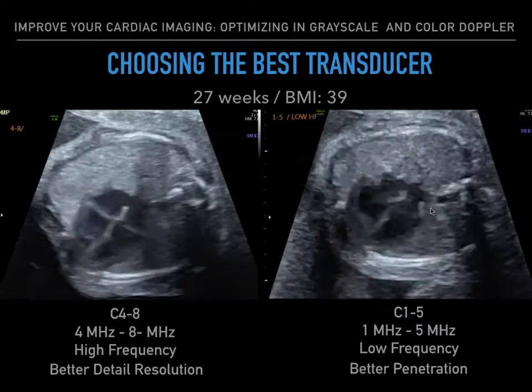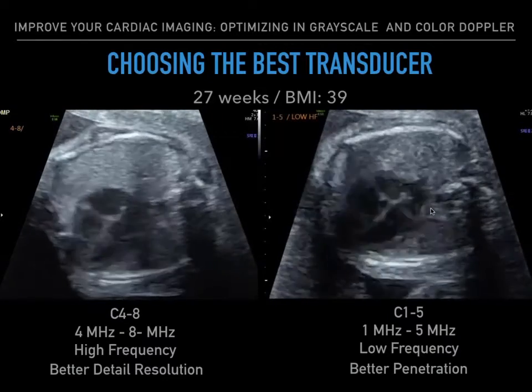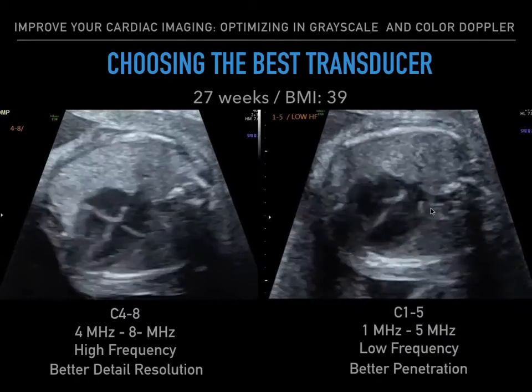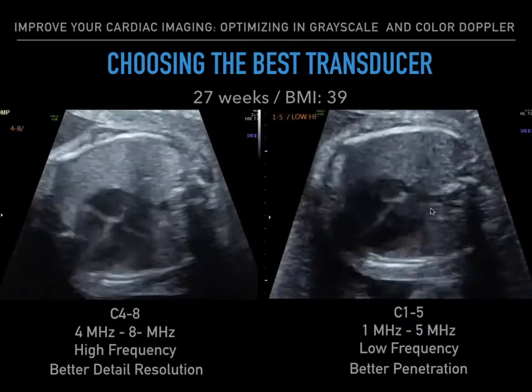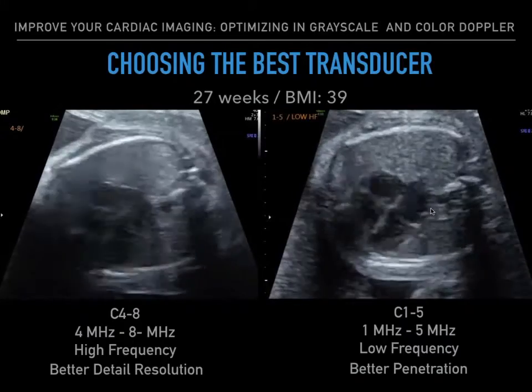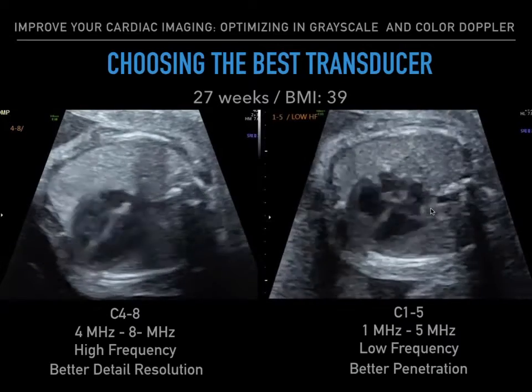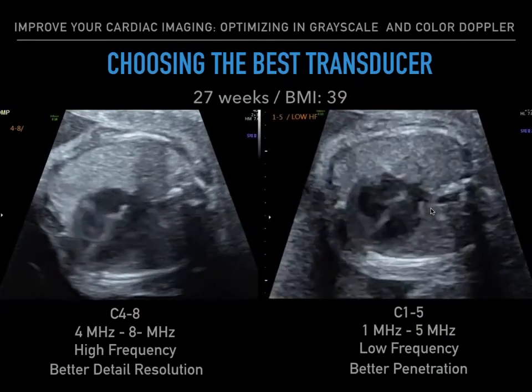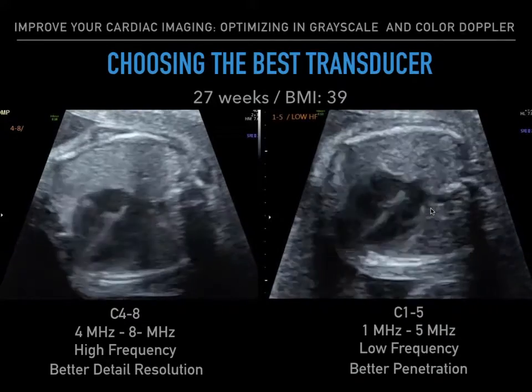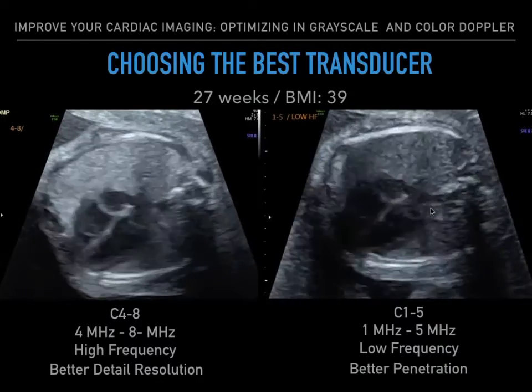So now it all comes down to choosing the best transducer. Here's a 27-week fetus with a patient BMI of 39 scanned with 2 different transducers. The C4 to 8 high-frequency transducer provides great detail resolution with a bit of shadowing as we pass through the ribs, and this is due to the reduced penetration. The C1 to 5 low-frequency transducer provides better penetration, as we can see a crisper view of the heart, yet resolution is slightly decreased, giving it a slightly grainy appearance. So again, it clearly depends what you are aiming for, better resolution or better penetration.